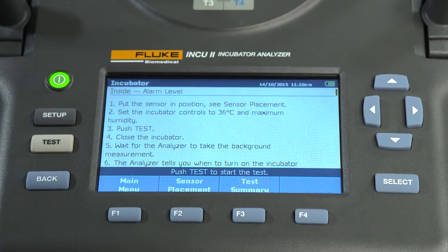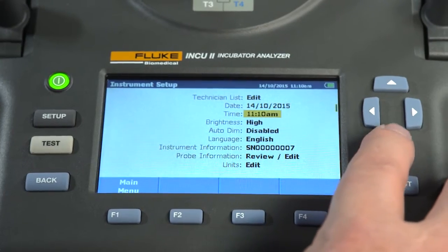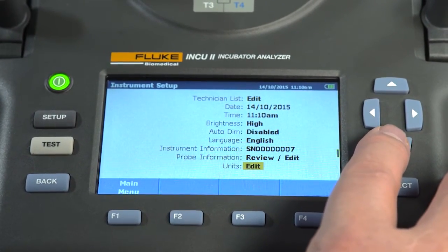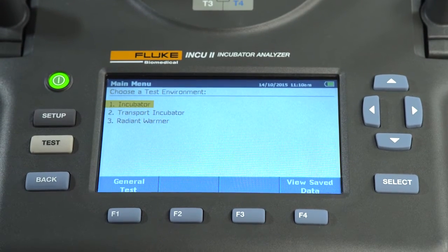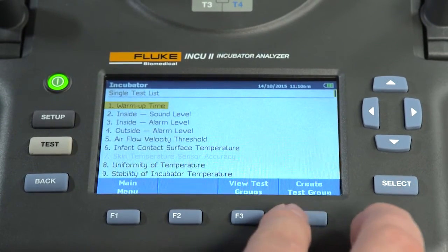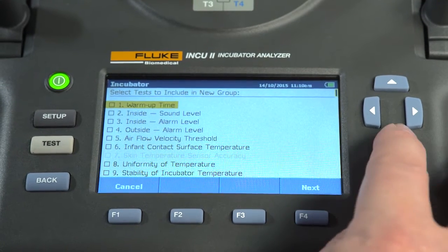The INQ-2 displays test results in real time. At the end of a test, either pass or fail indicators will be displayed. The setup button allows you to change your measurement units, view the details of the device, and select your sampling rate. The back button allows you to go back to the previous screen. Along with using the standard tests, you can create your own testing groups or unique testing procedures, which can further increase efficiency and tailor testing to your facility's protocols.